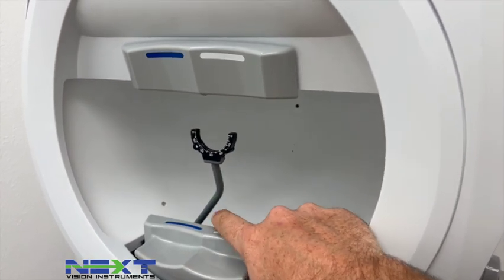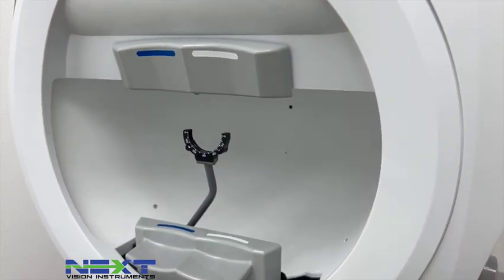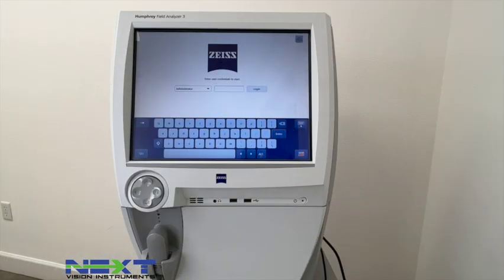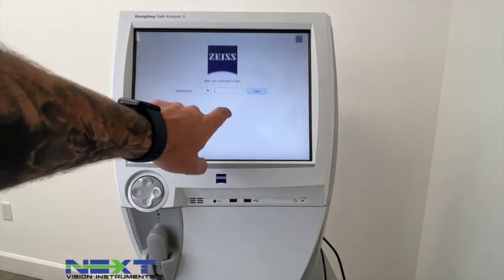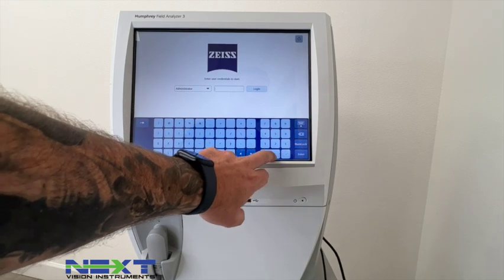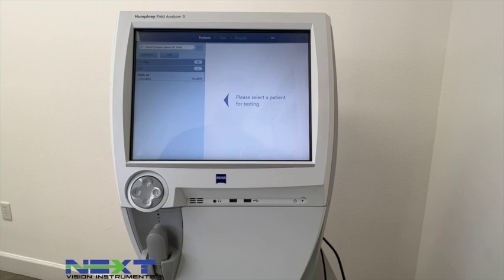On the model 840 — which is the one we're looking at — you have the standard trial lens holder. The next model up, the 860, will have a liquid lens trial lens that you can plug in here; we'll cover that in a later video. Once it boots up you'll come to this screen and it'll ask you to add a password — it should be four zeros. You can do this either by touchscreen or on your keyboard.